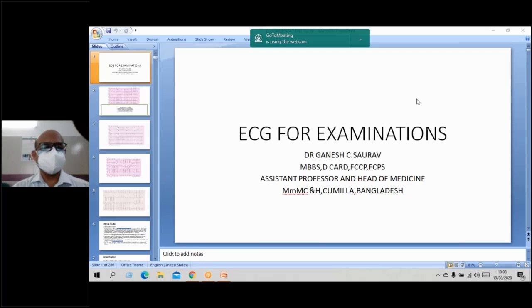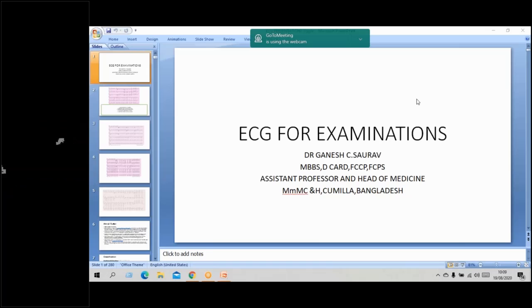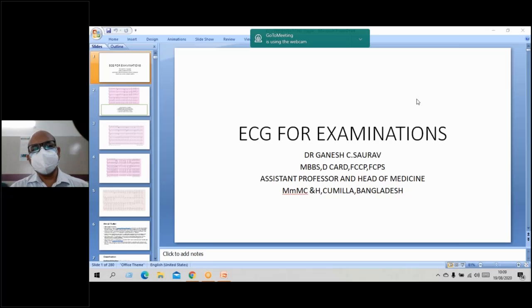Dear students, today I will discuss some review topics, which are important for your examination. Today I will discuss some important ECG that was already discussed in previous class, but there are sometimes for review this discussion, and this is very important for your examination, both Viva as well as OSPI.